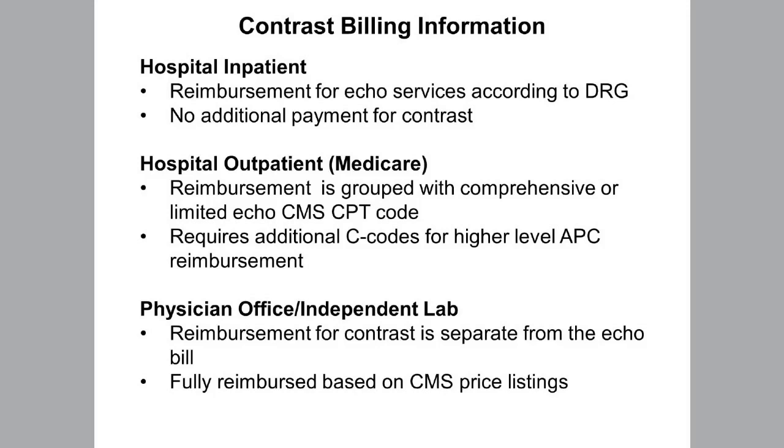We just specially order for our department the bacteriostatic saline that comes in vials as opposed to the prefilled syringes. Yeah, I want to reiterate that we have the same policy in our lab: sonographers really are not allowed to do that without some supervision, and that's mostly for their own protection. If you are doing it, make sure you maintain appropriate PPE, personal protective gear, including gown and eye cover, because of the risk of turning the syringe the wrong way and getting a splash. That being said, the reason blood works is that when you agitate saline with blood, you have a surfactant in there, which is albumin and some other proteins as well, and it tends to stabilize the bubbles.